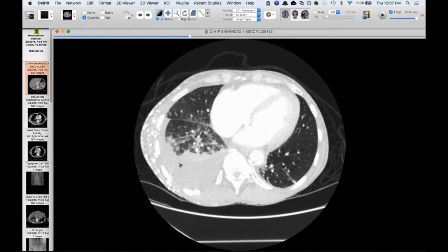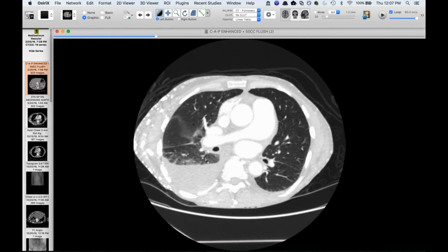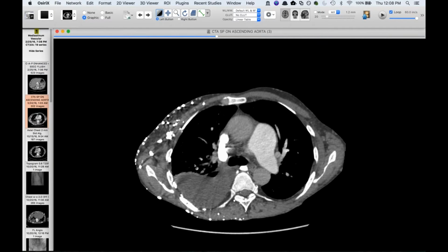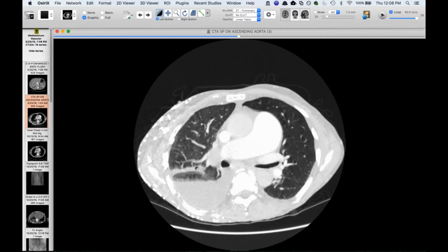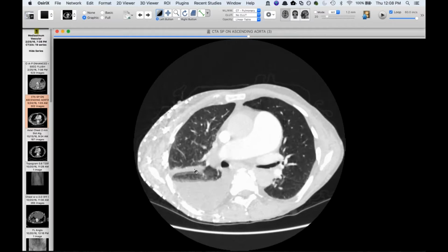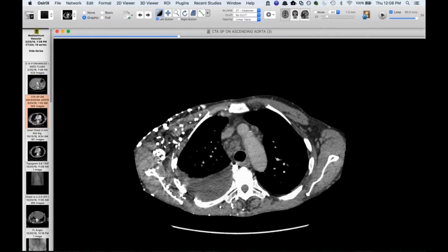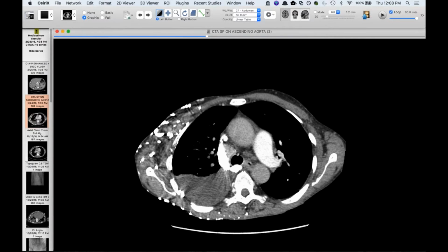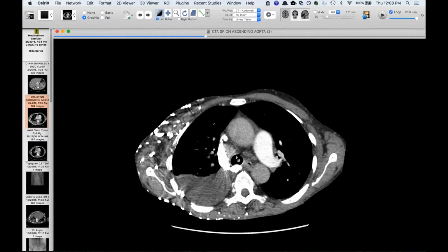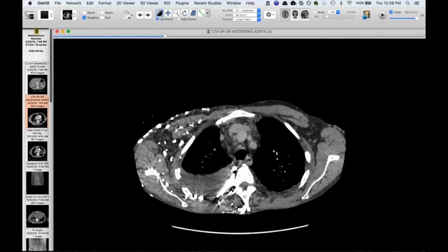So this was back in February of this year, and you can see he's got a little bit of septal thickening and some peribronchial fluid cuffs that we'll come back to in a moment. But his effusion is still there a few months later, and they tap it, and they keep getting chylous effusions. And so the first part of this is that he has a recurrent chylous effusion, which has been reported in case reports due to SVC syndrome. So this was the first case of this I had ever encountered. They tried to do an angioplasty and open up his SVC, which I guess they were able to recanalize for a while, but his chylous effusion never went away.